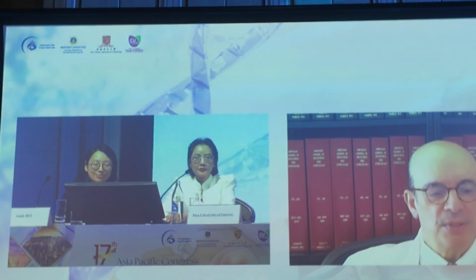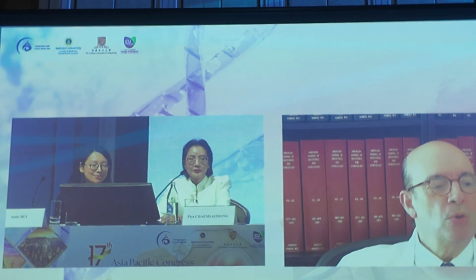To use, let me just see. No, I'm going to go on to sludge.